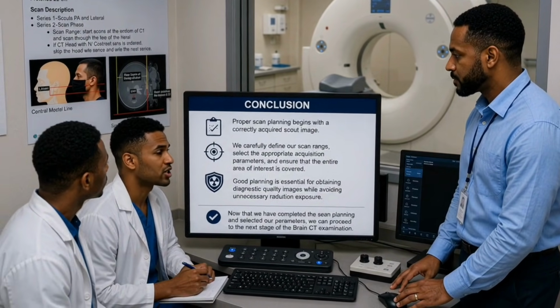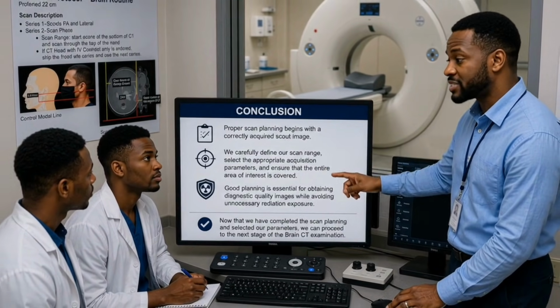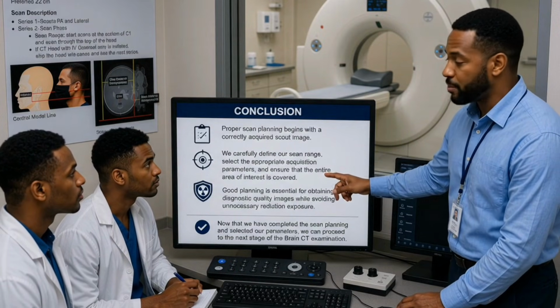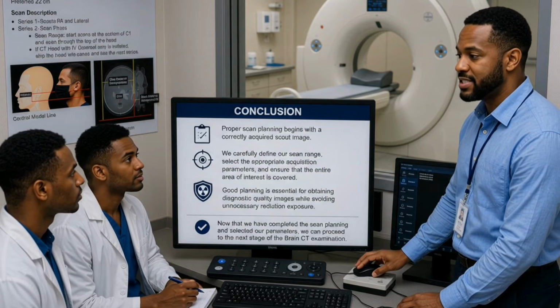What about the radiation exposure? Remember, good planning is essential for obtaining diagnostic quality images while avoiding unnecessary radiation exposure. Now that we have completed the scan planning and selected our parameters, we can proceed to the next stage of the brain CT examination.